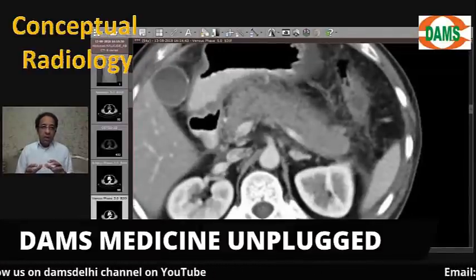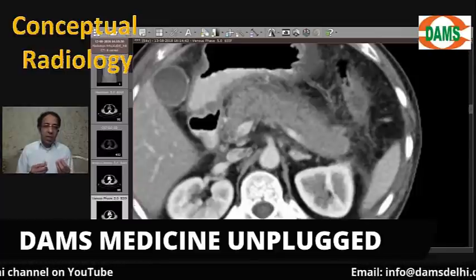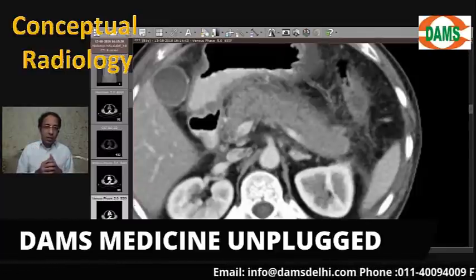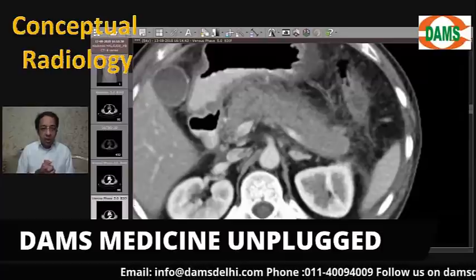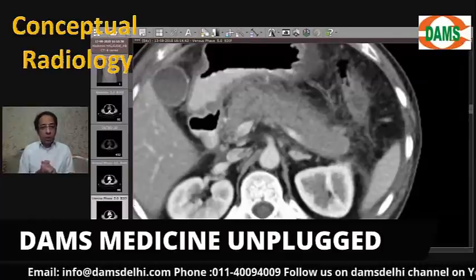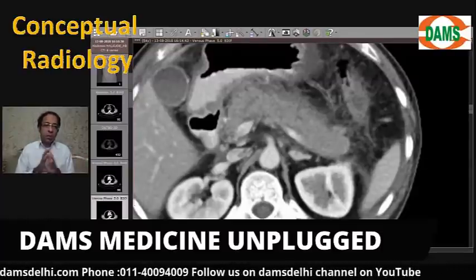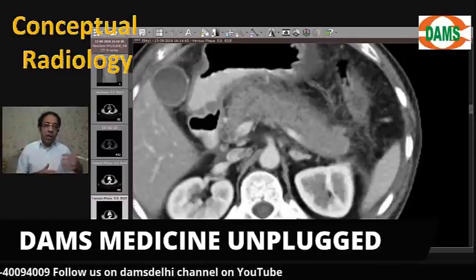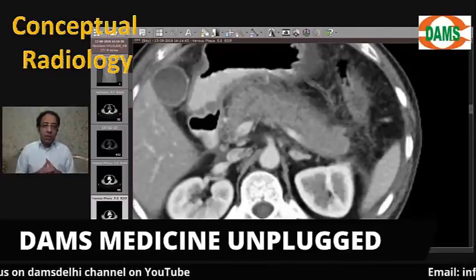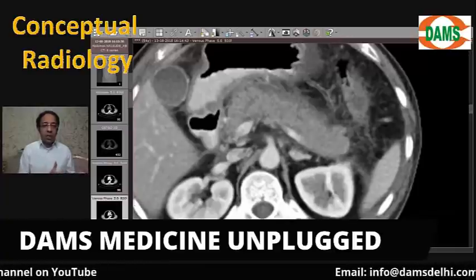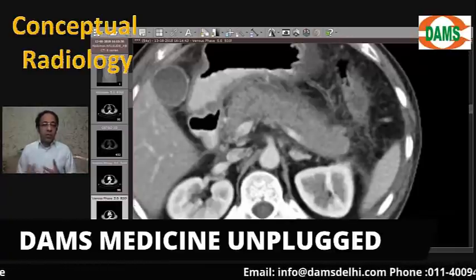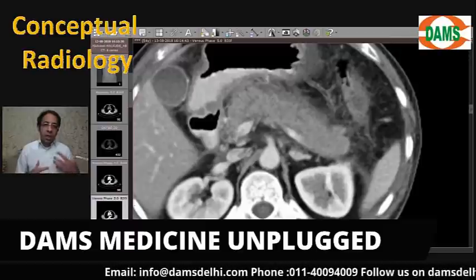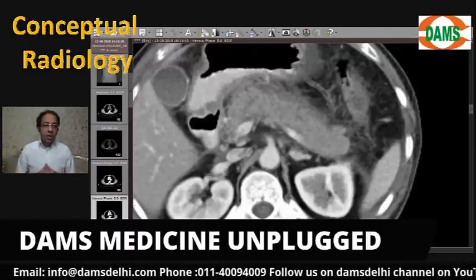Although this pancreas is diffusely enlarged and appears slightly hypodense, there is no non-enhancing area. That is of great value - right now we are thinking of acute pancreatitis, which is classified into a milder form called interstitial pancreatitis and a severe form called necrotizing pancreatitis. Necrosis would be seen as a non-enhancing area on contrast CT, and here we don't have any such area.